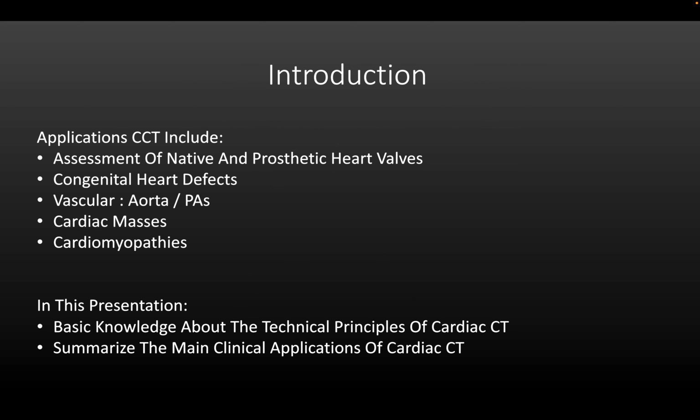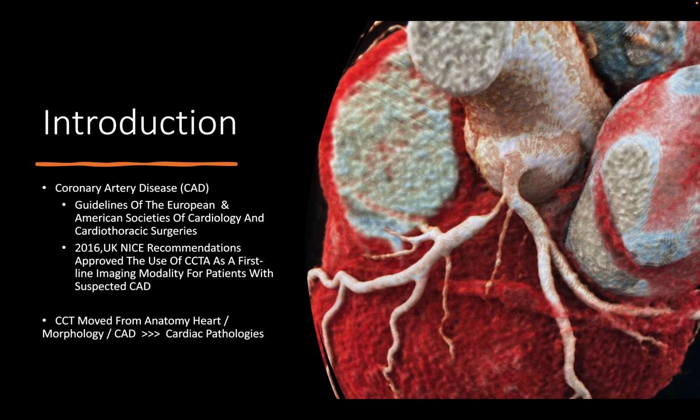In addition to the role of cardiac CT in coronary artery disease, there are many applications for CT, for instance, assessment of the heart valves, whether native or prosthetic, congenital heart defects, vascular diseases, aortopathies, pulmonary hypertension, detection of cardiac masses, and sometimes cardiomyopathies as well. So let's go through some of these indications.